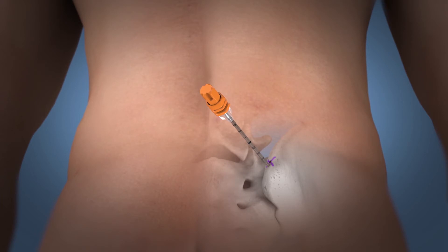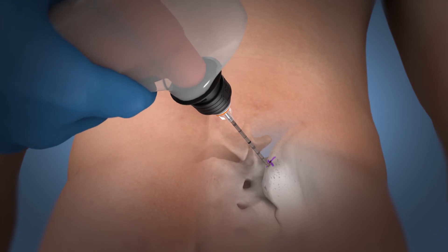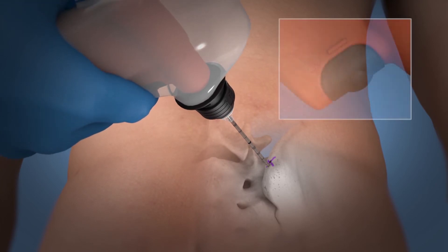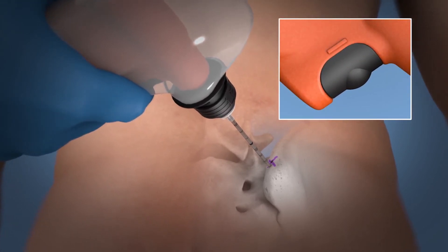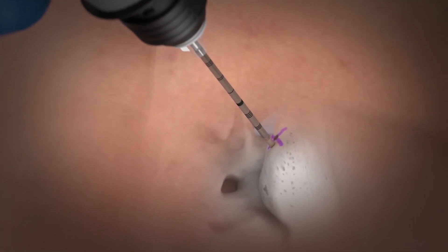Gently attach the OnControl driver until an audible click is heard, which indicates attachment. Engage the driver trigger continuously with one to two pounds of downward pressure until the cortex is penetrated.